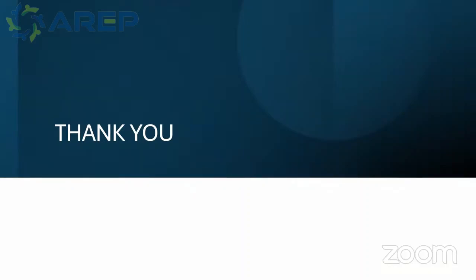Dr. Usha? So the dynamic is different and the 30 to 40 second is different. For the dynamic MR, the imaging starts about 30 seconds before the injection of contrast and continues for up to 4 minutes. We do that because sometimes we may need subtraction images, so we start pre-contrast and continue with a temporal resolution of at least 15 seconds, so we are able to get accurate curves. And the non-dynamic is just one post-contrast image.